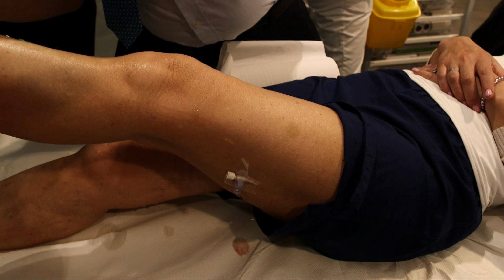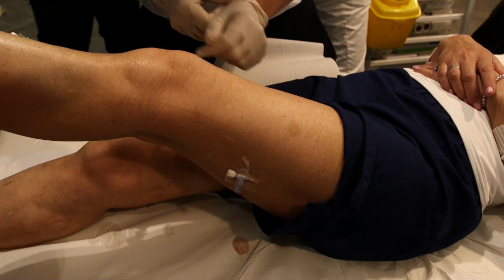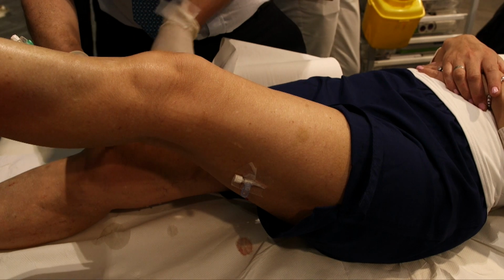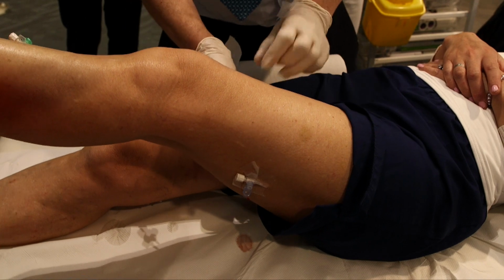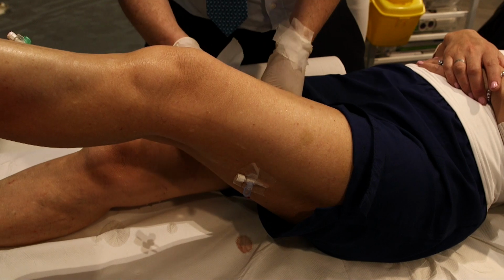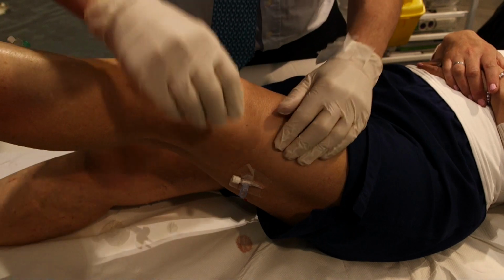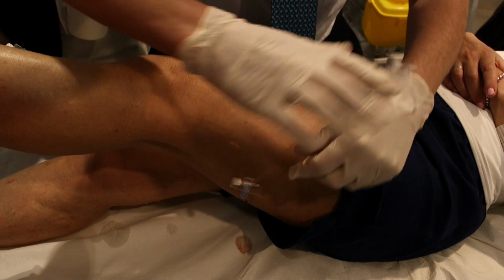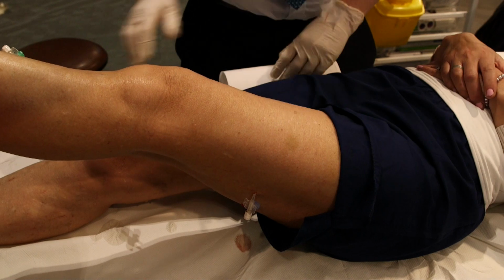Right, time to bandage the leg. The best bit. This will be your friend for the next week. My friends from the Whiteley Clinic would like it to be 3 weeks, but I said I'd let you off. I'm not sure. Nobody knows, actually, for sure. Professor Fegan wanted 6 weeks, but he was very mean to his patients. He also made them walk 3 miles a day as well, which doesn't have any proven scientific efficacy.